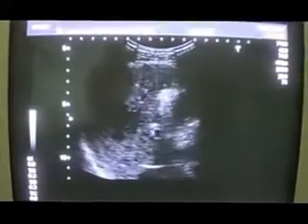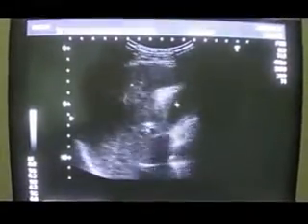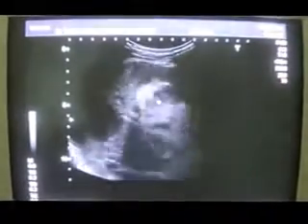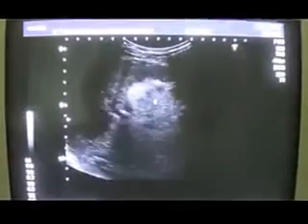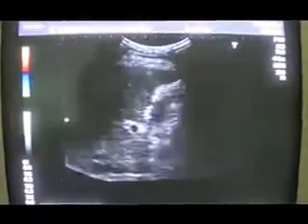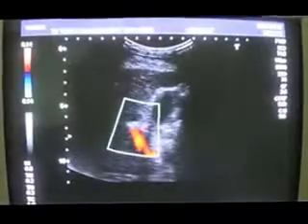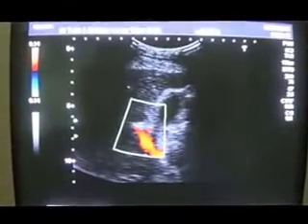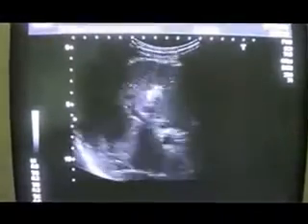and this is the gallbladder with thick echogenic walls being seen because of the adjacent liver parenchymal disease, and no pathology otherwise. Well, this is the portal vein, as you can see here. Now this is the portal vein, the gallbladder. The portal vein is patent, the flow is normal.